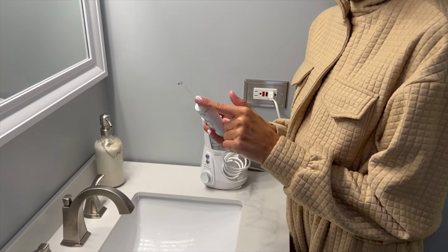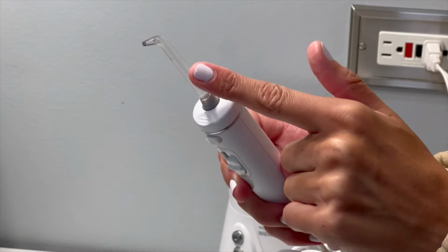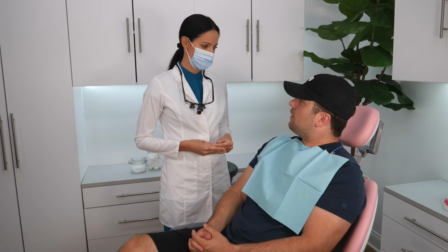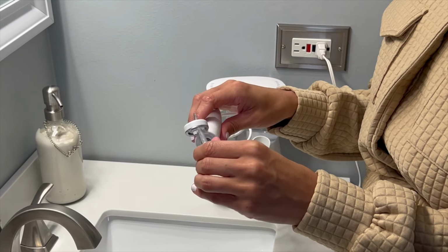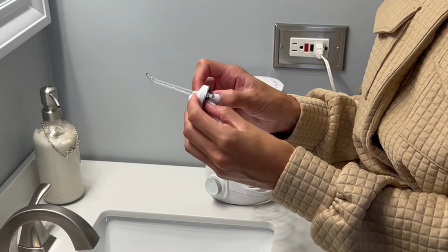Next, select the best tip for yourself. I'm using the default regular tip, but there's additional options for braces and other things. So talk with your dental provider and they will help you decide which tip is best for you. Generally, anyone can use the regular default tip, so insert your tip into the handle, then decide which pressure setting you're going to use.